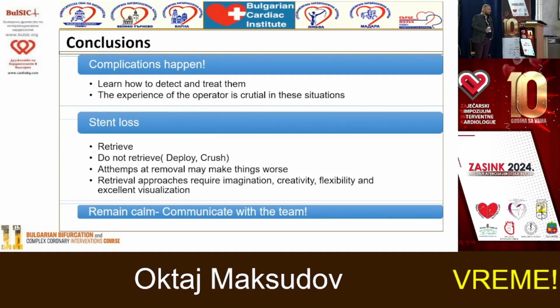So, what are the conclusions? That complications happened, and we must learn how to detect and treat them. The experience of the operator is critical in these situations.